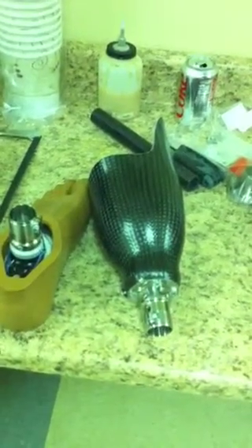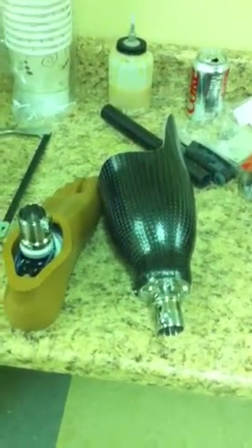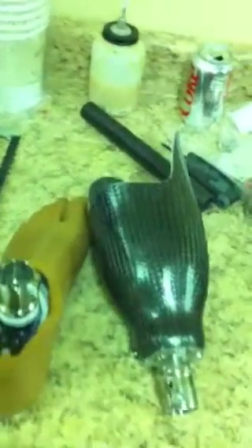This is actually a bilateral patient — his left leg. Right now we are sanding down and buffing the pylons. The pole that goes from the foot to the socket, which suspends the socket at the appropriate height, is called the pylon. This is called the socket, and this piece that extends out is called a tube clamp.